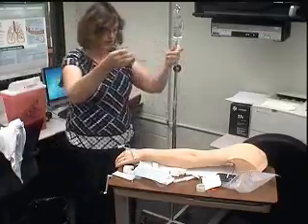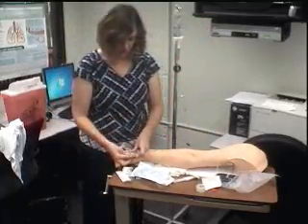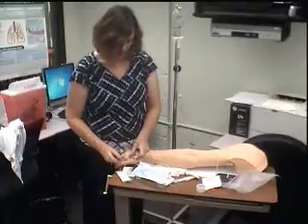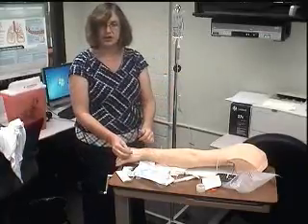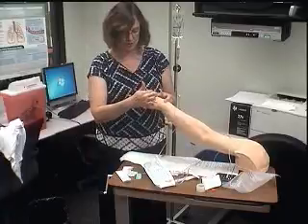Now I need to hook this up. I'm going to hook this directly to my saline lock extension tubing. This here is the lock part. This was the extension tubing that went into the patient.